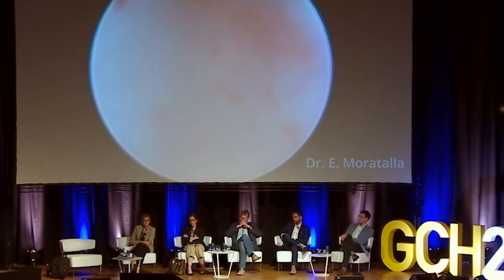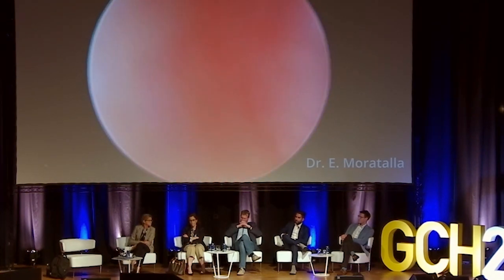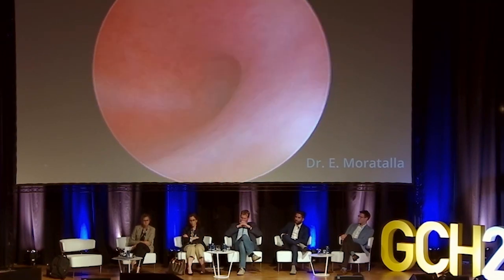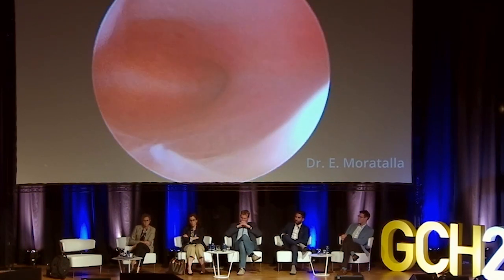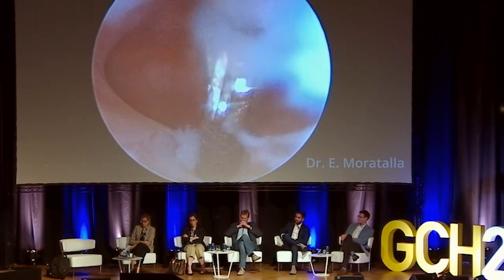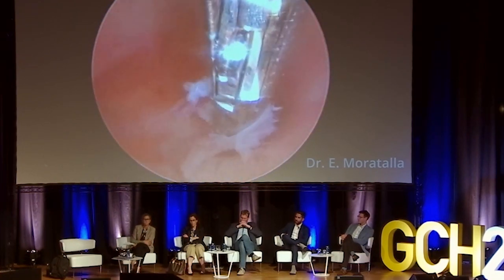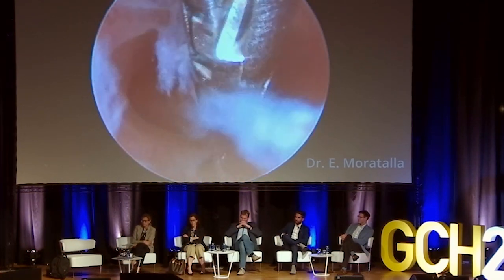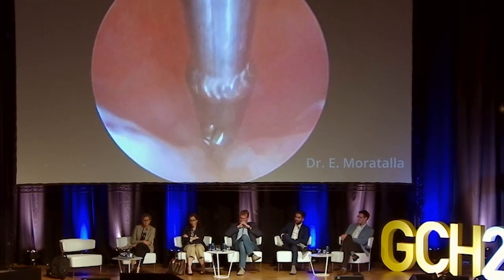We began by performing a hysteroscopy, passing through the endocervical canal and visualizing the cavity. It is a regular cavity with a proliferative first phase endometrium. We always perform a biopsy prior to the endometrial ablation. In this patient, the anatomopathological result was proliferative endometrium.